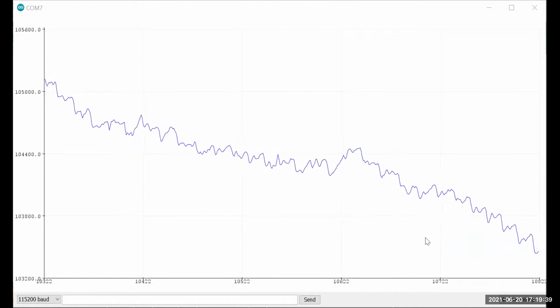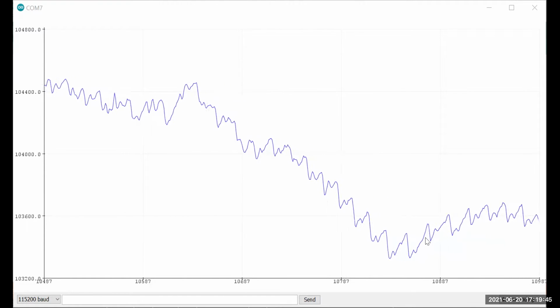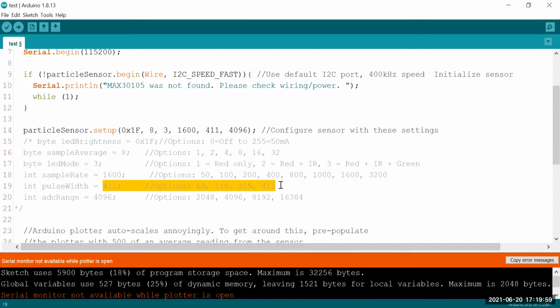And now you can actually see the rapid shifts down, and I picked a very fast rate of samples just so that this scrolls by quickly. And now I take my finger off, and you see the auto scale makes it not even visible. Let's go back to the code, share screen, code, and then my pulse width.